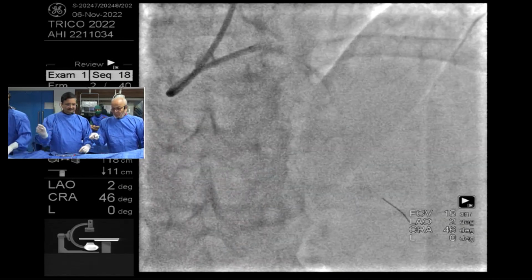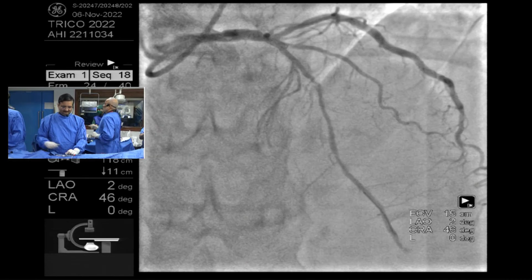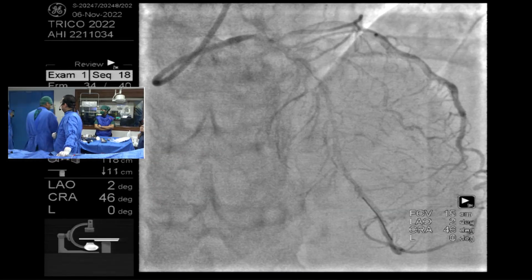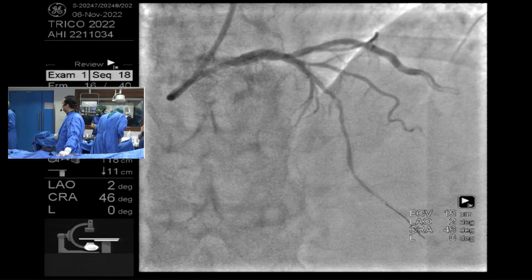You know, there is a point. We don't want that. Yeah, get me 2 point. Which one you have? Get me 2 by 15 or 2.5 by 15 NC emerge.